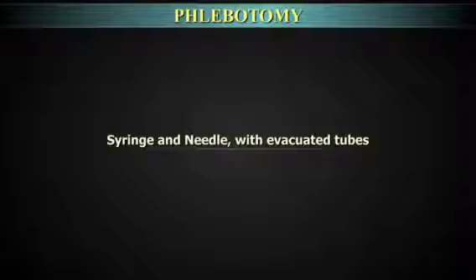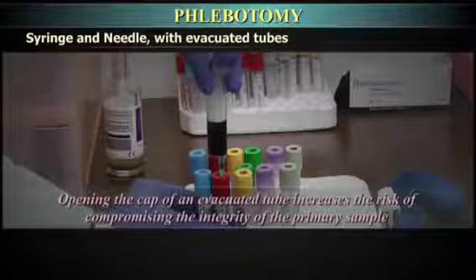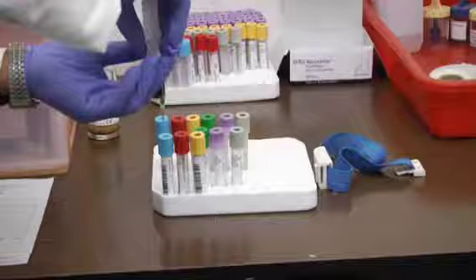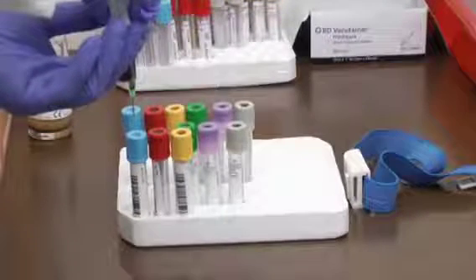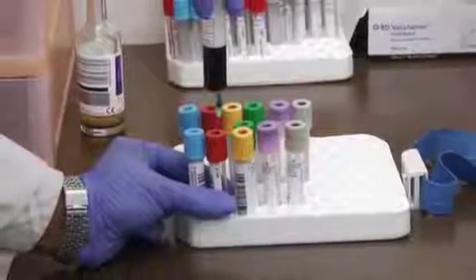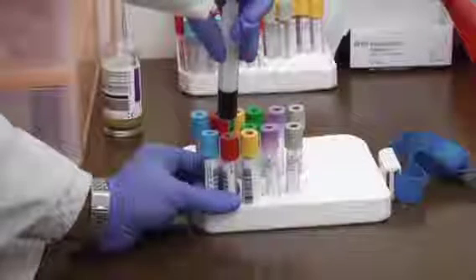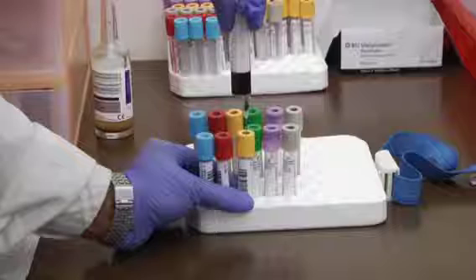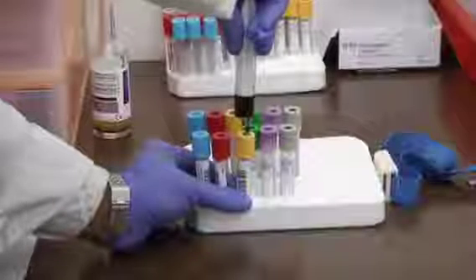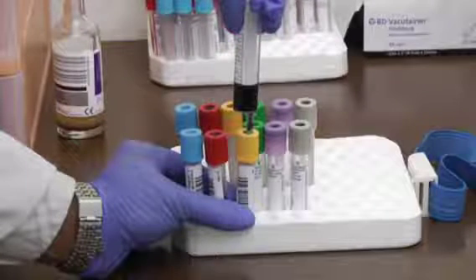When using syringe and needle with evacuated tubes, opening the cap of an evacuated tube increases the risk of compromising the integrity of the primary sample. If a syringe is used, it is recommended to place the tube into a rack before filling the tube. To prevent needle stick injuries, use one hand technique to puncture the tubes with the needle to fill the tube under vacuum. Pierce the stopper on the tube with the needle directly above the tube using slow, steady pressure. Do not press the syringe plunger because additional pressure increases the risk of hemolysis.